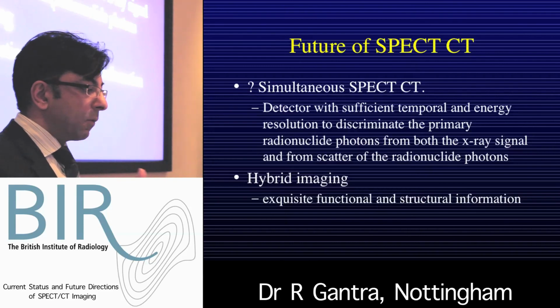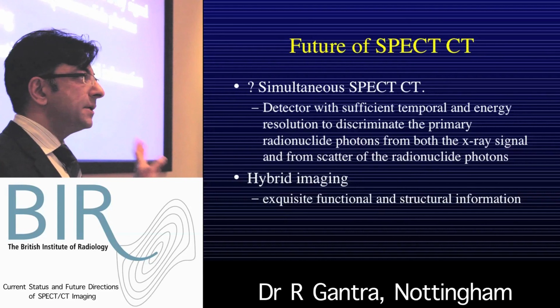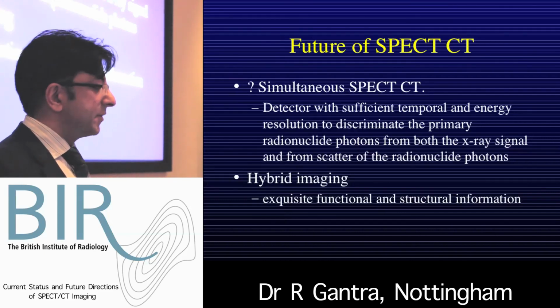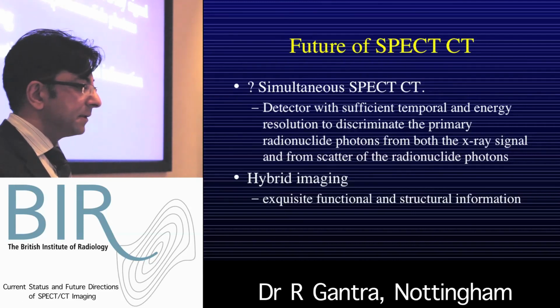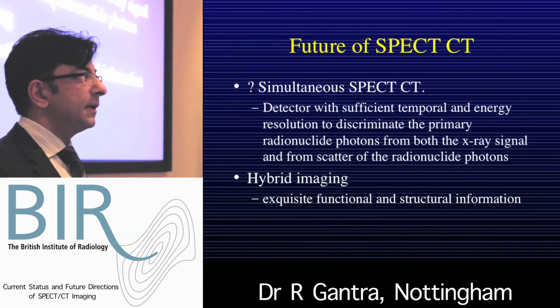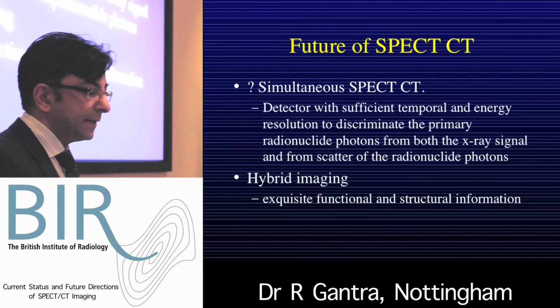And really where I think imaging is going, and I think this divide between nuclear medicine and radiology is already happening, my prediction is within 5 to 10 years that will go with this hybrid imaging, because we do need functional data, we do need structural data, and I think if we can optimize both, that's the way that imaging will and can go.